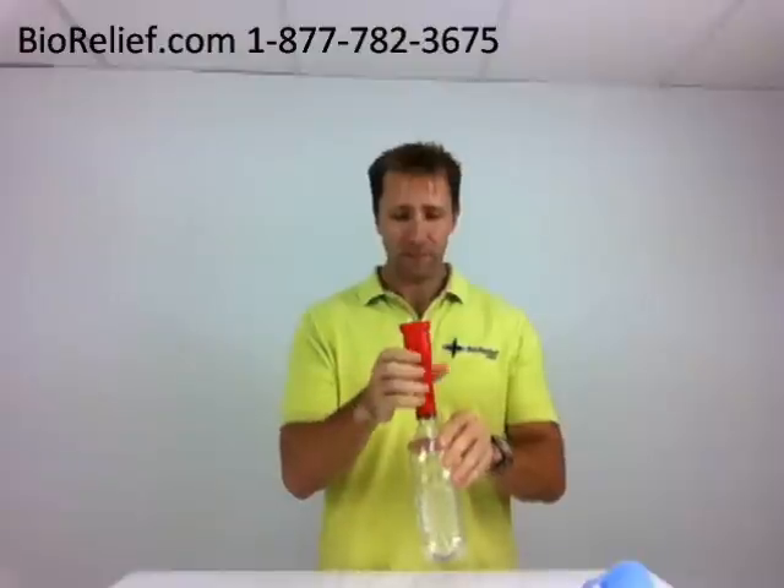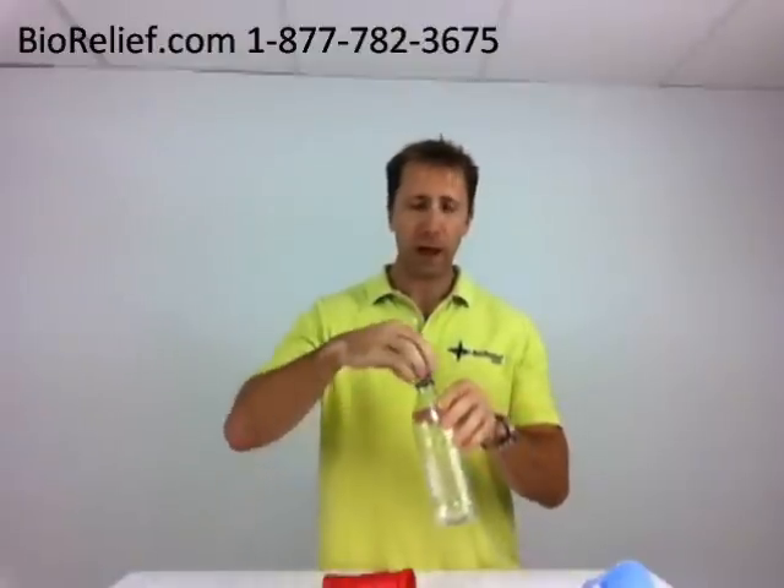So now you can use this to channel the urine into the bottle, and then when you're done with it, use your cap — now it's sealed so you can dispose of it later.